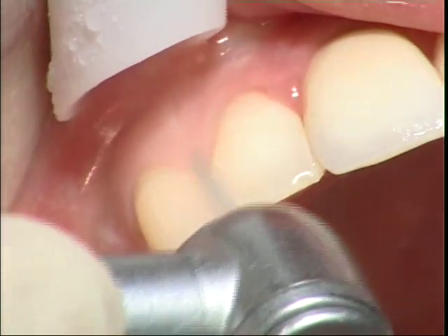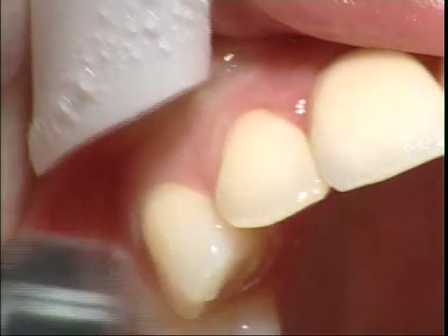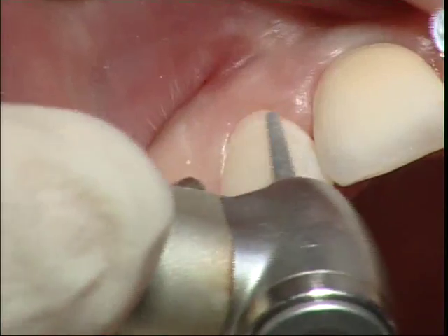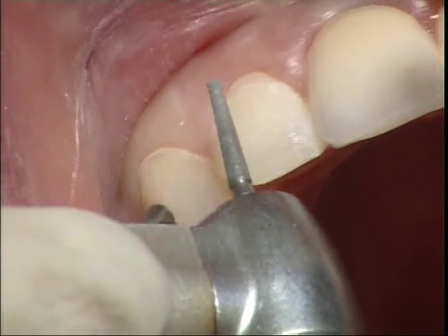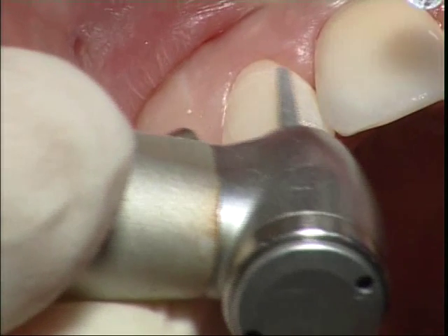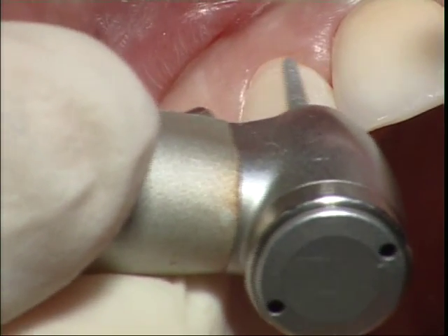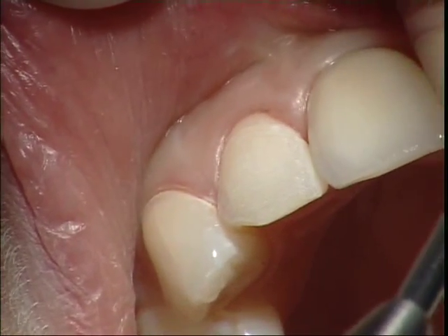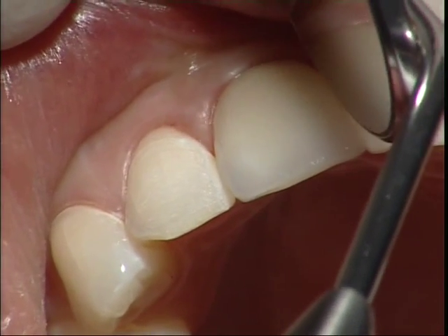It is not more than 0.2 mm — that's a little bit more than two pieces of paper. We are not going through the approximate area usually. We are keeping the contact points in the tooth enamel. In the cervical area, as you can see, I am now cutting dry, with air cooling. Since I am in enamel, that's okay. I can see them better. From the side I can now see that the finishing line is very shallow in its preparation.